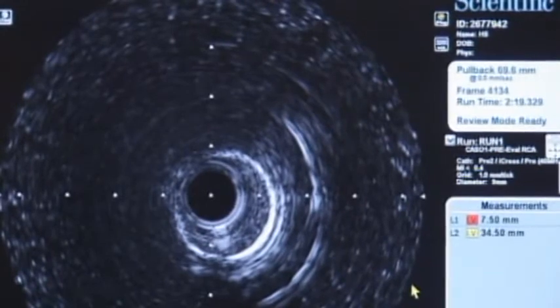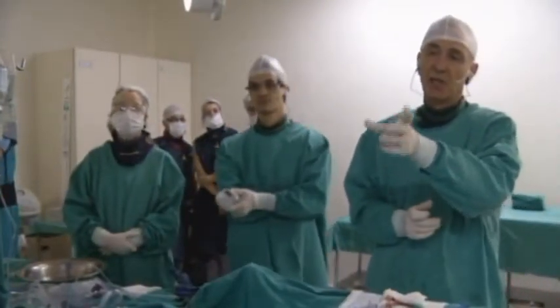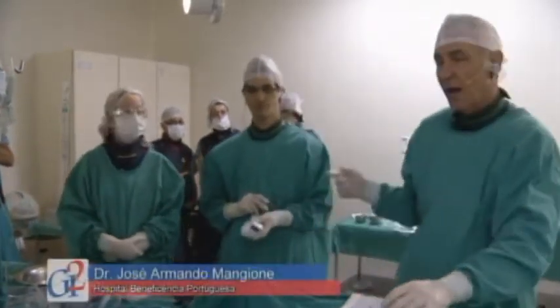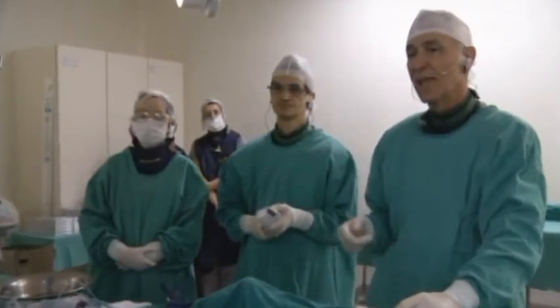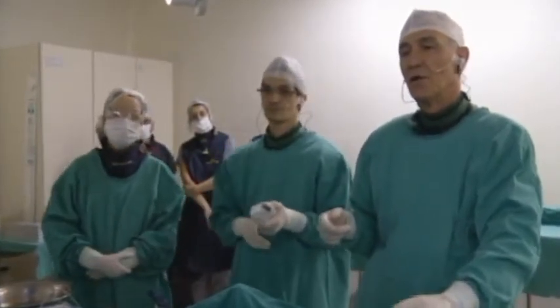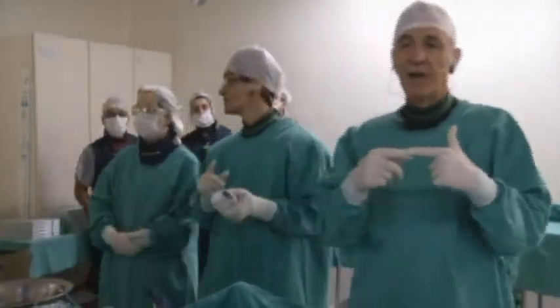So we implanted a 2.5 stent, 28 in length, in the distal part of the artery, according to the IVUS results. We implanted another stent, performing a small overlap between the stents, as you can see on the screen.